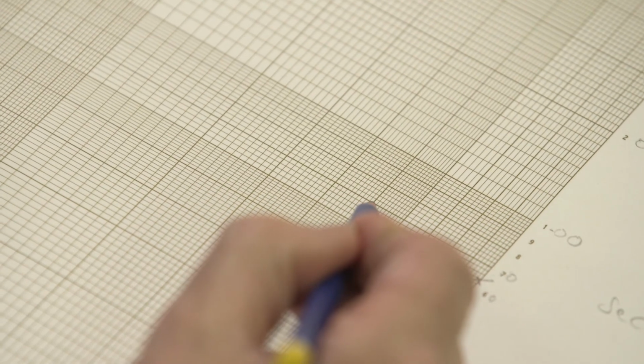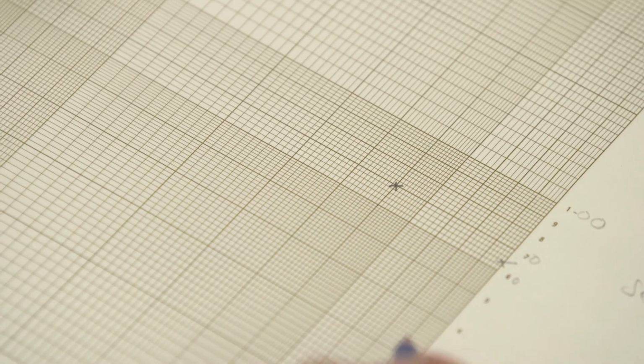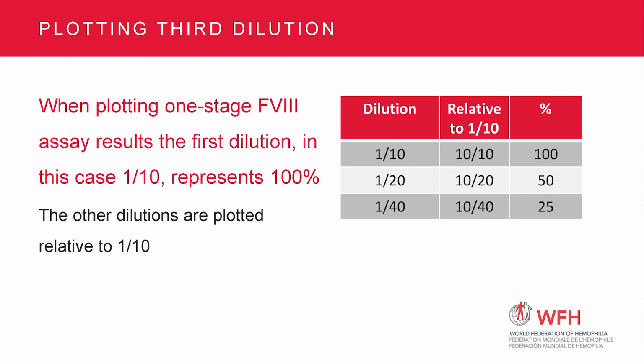So for the standard, 1 in 20 dilution, 69 seconds, 70 seconds. Very close. Take an average, 69.5. 1 in 20 dilution, 50% line, 60, 2, 4, 6, 8, 69.5. Of course, it's just beneath the 70. Third dilution of standard, 1 in 40. What's the concentration relative to the first dilution?